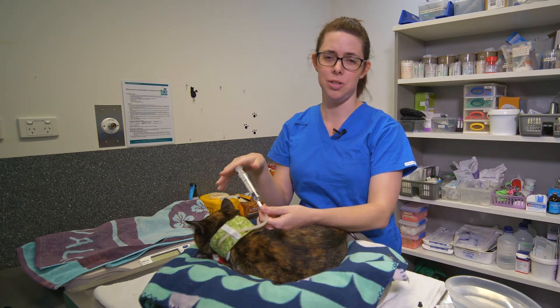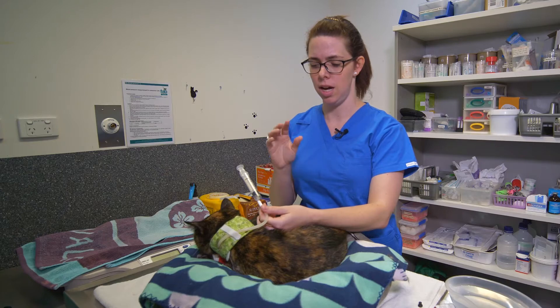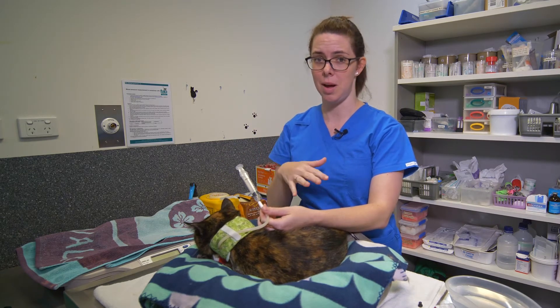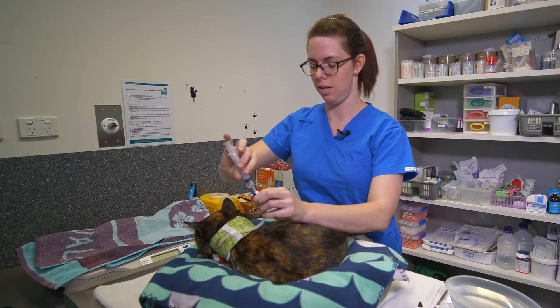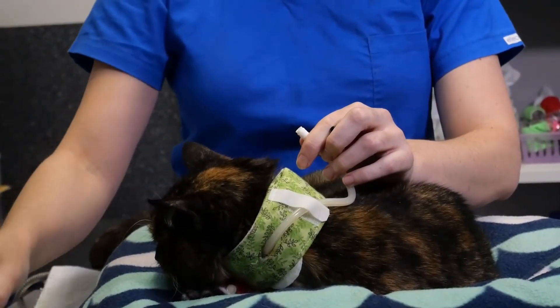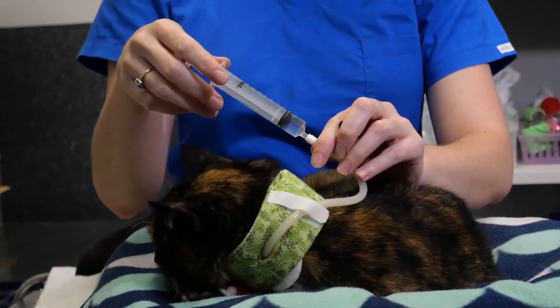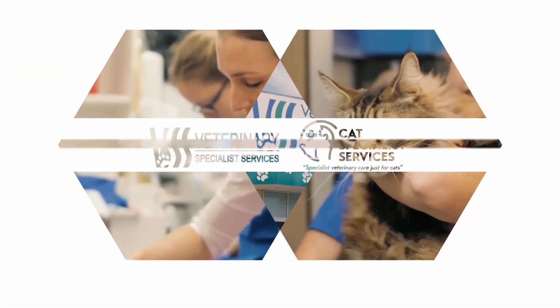If you ever have issues with the tube feeling blocked or get some resistance, a good thing to do is add a little bit of soft drink into a syringe, put it down the tube, cap it off, and leave it for about 10 minutes. Then try flushing through again with water. If you're still having difficulties or there's a blockage, give us a call and we can provide advice from there.